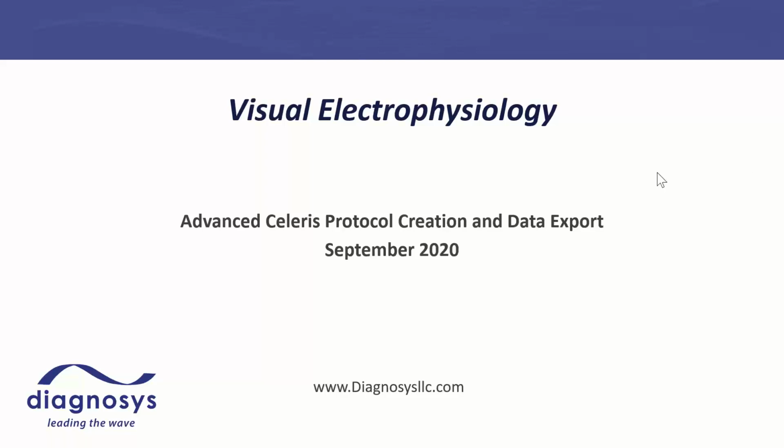All right. Well, we have a great presentation for you guys tonight. We are going to talk about protocol creation and customization, as well as raw data export for analysis and third-party tools. Anna-Rosa from our European office is staying up late for us tonight. She's also going to introduce a brand new bulk exporting tool that we've just released.